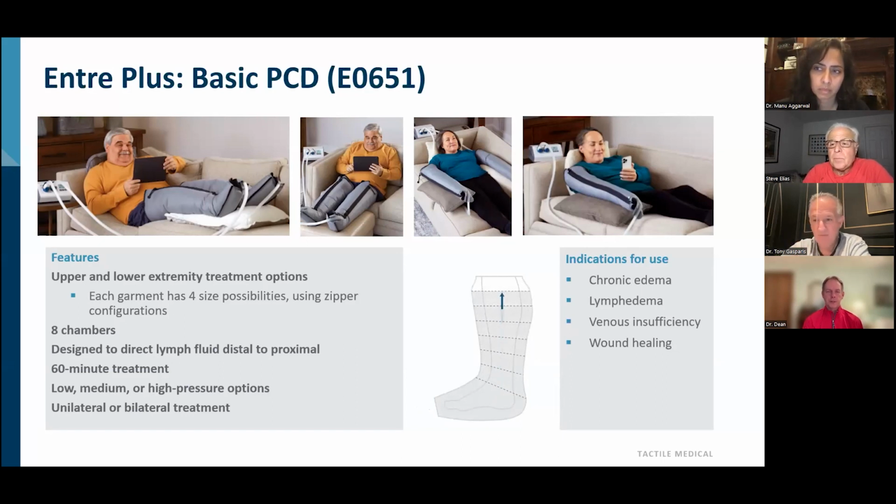Hold and squeeze. Hold and then squeeze, right. And what's the duration of that whole cycle from start to finish? Steve, do you know? The whole cycle? I think we have that on the next slide. 30 seconds, right? So the patients are being, like you said, the hold and the squeeze.